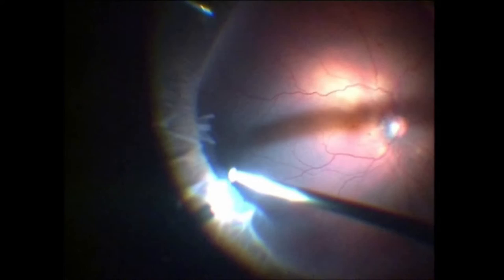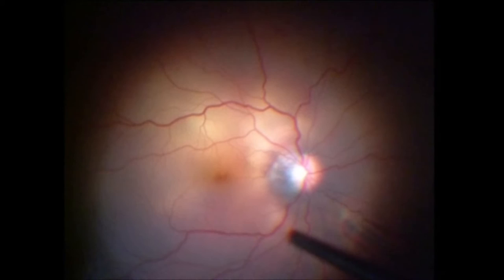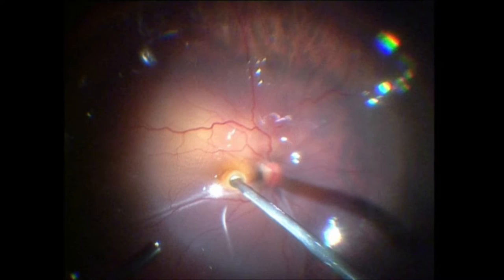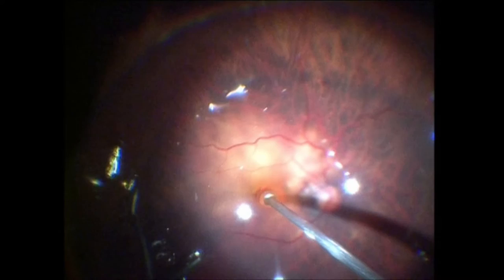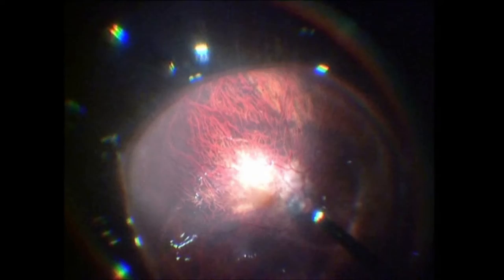However, the patient developed a redetachment after a month and a vitrectomy was undertaken. On the table, the site of previous tears was assessed and they seemed to be well indented by the buckle effect. A thorough vitrectomy was carried out and no other break was noted. This was followed by air-fluid exchange, at which stage fluid started draining from a macular hole — it could have been a missed break from previous surgery or a secondary break formed thereafter. After drainage, good flattening of the retina was noted.